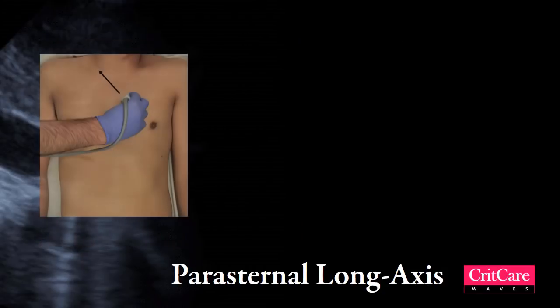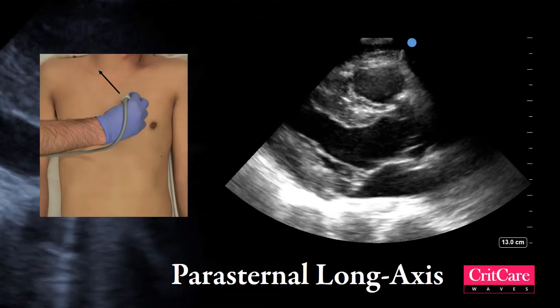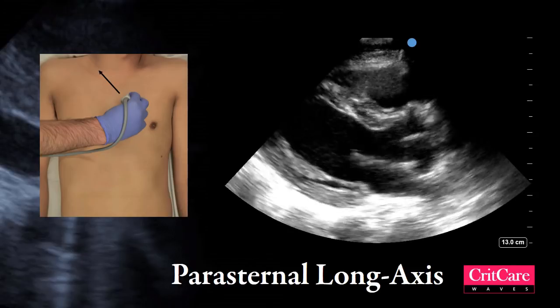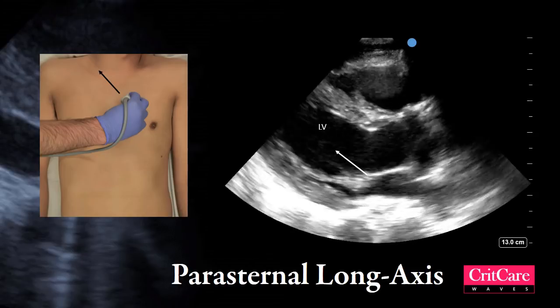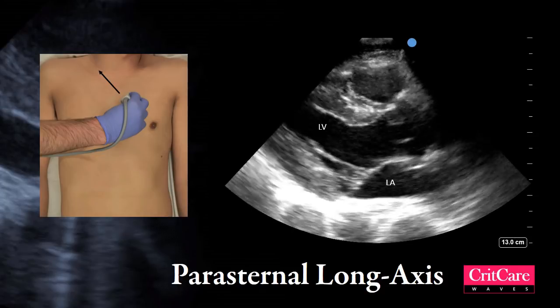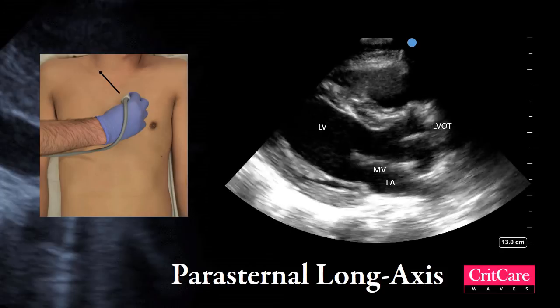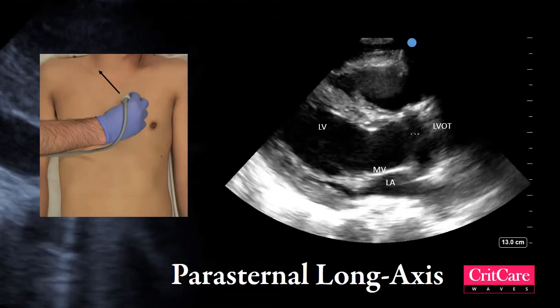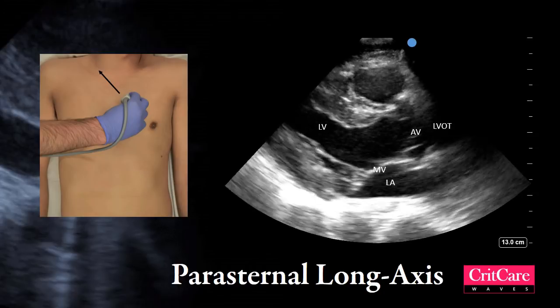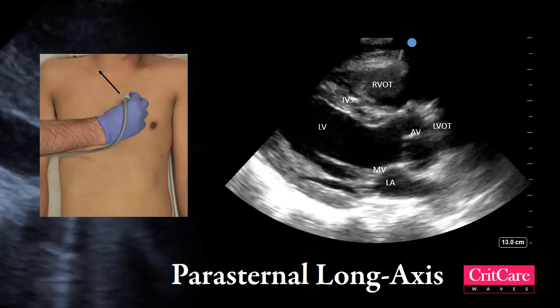This is a parasternal long axis view. The easiest way to figure out anatomy is to identify a chamber and the direction of blood flow. The thick-walled chamber is the left ventricle. Blood flows from the smaller chamber — the left atrium — into the left ventricle, with the mitral valve in between. The outlet is the left ventricular outflow tract (LVOT), and the aortic valve is seen proximal to the LVOT. The chamber closest to the probe is the right ventricular outflow tract (RVOT), with the interventricular septum between the left ventricle and the RVOT.